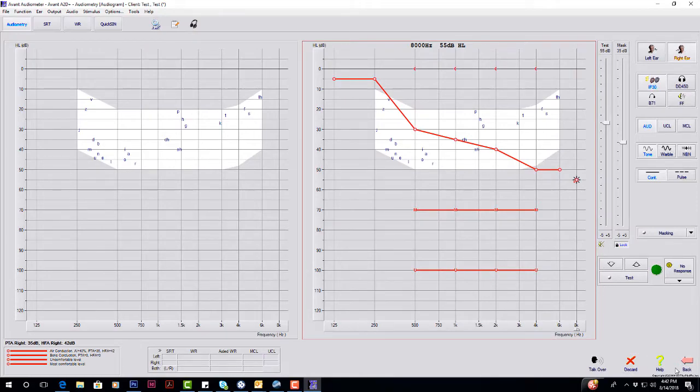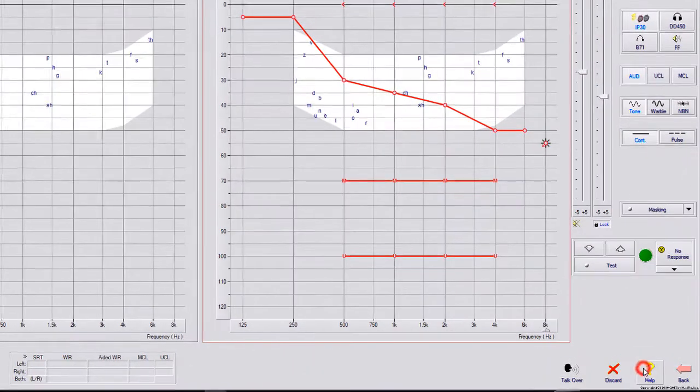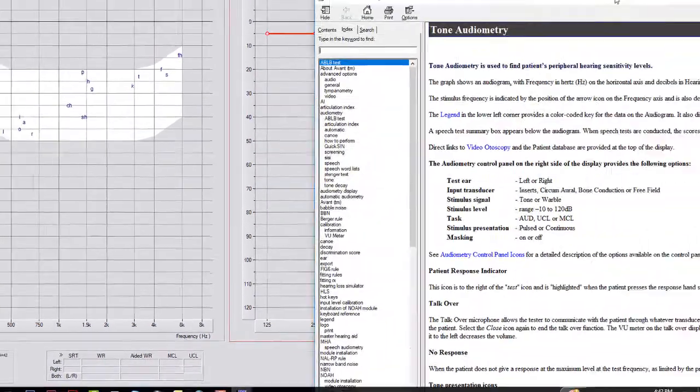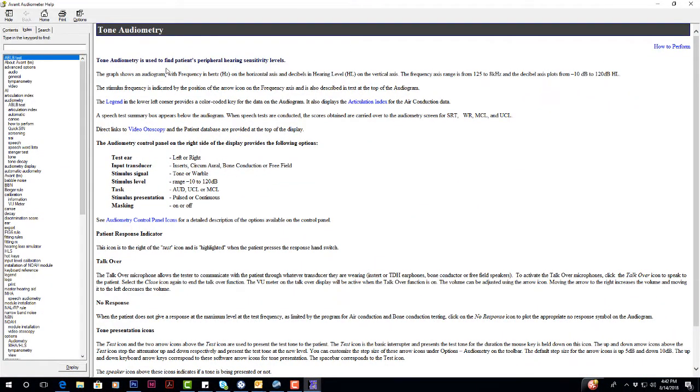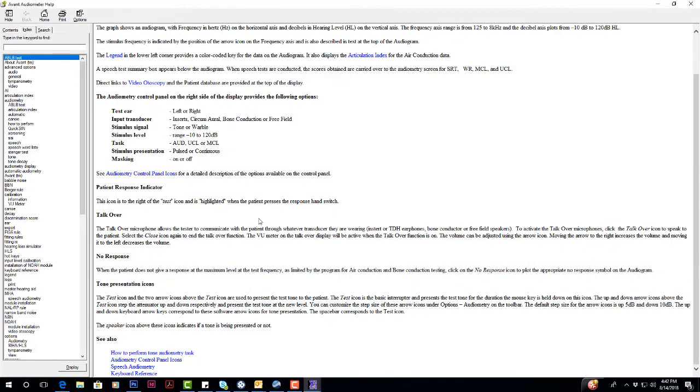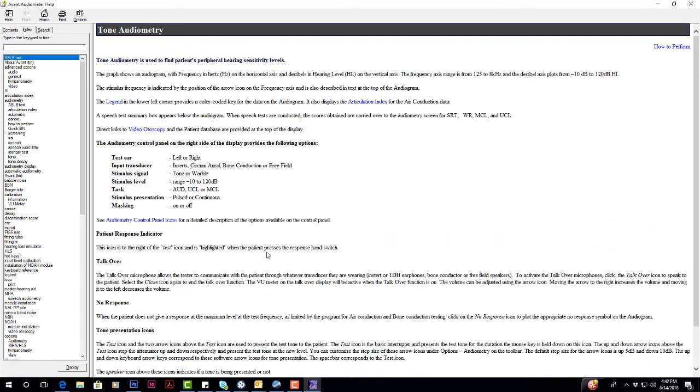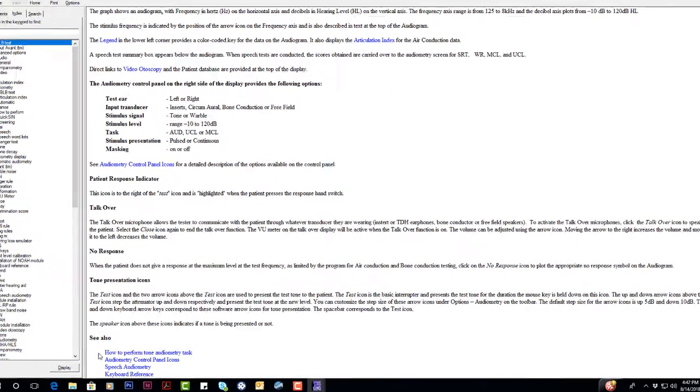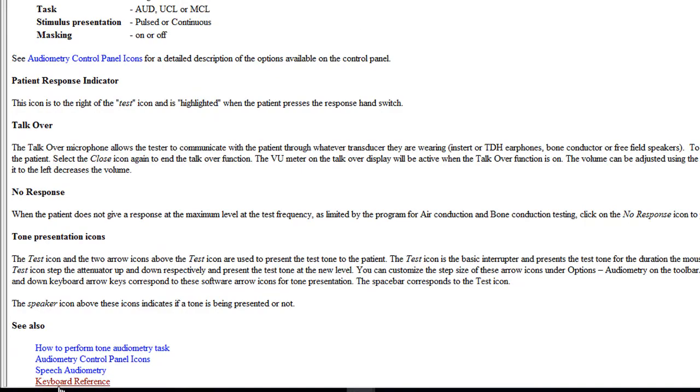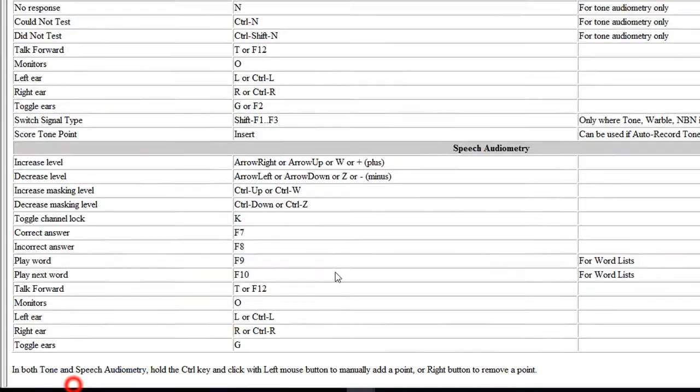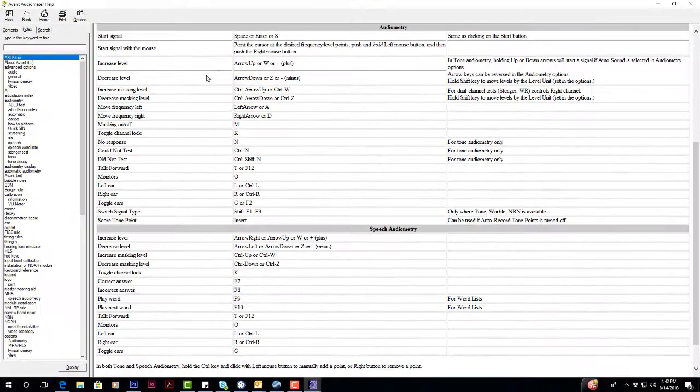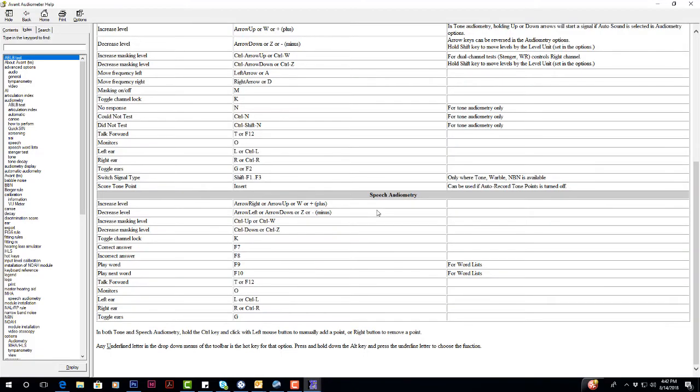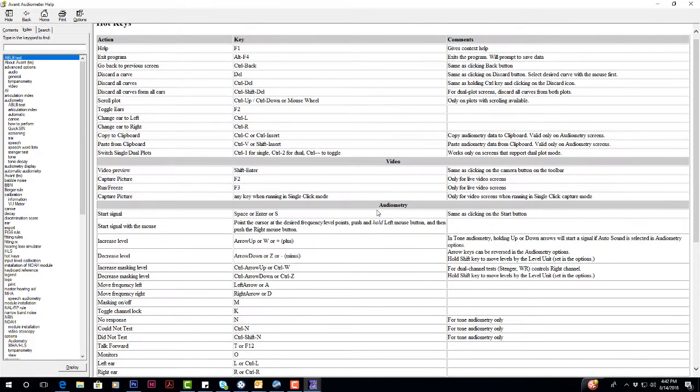To the right of discard, we have help. Help is very intuitive. One of the things that I always recommend is when you come into your help, if you scroll to the very bottom, you have in blue lettering keyboard reference. This is going to give you every single keystroke to do your testing. I recommend printing this off, highlighting the main ones or making your own list. Once you start using these different shortcut keys, your testing will go much quicker.